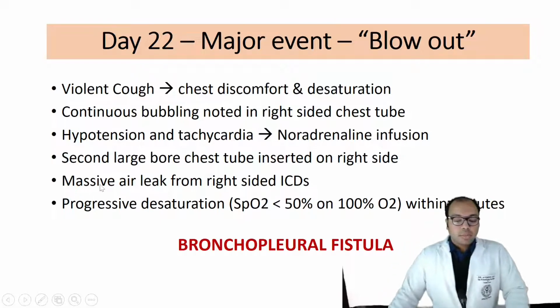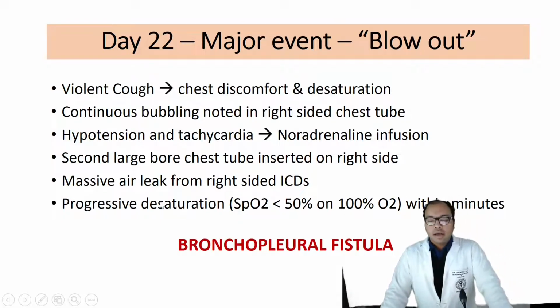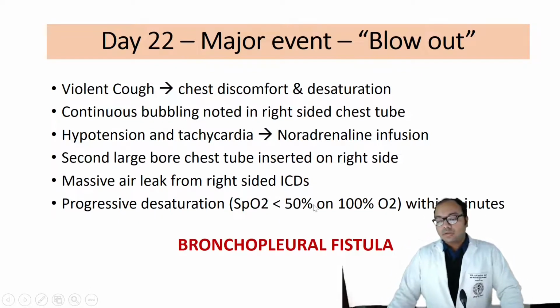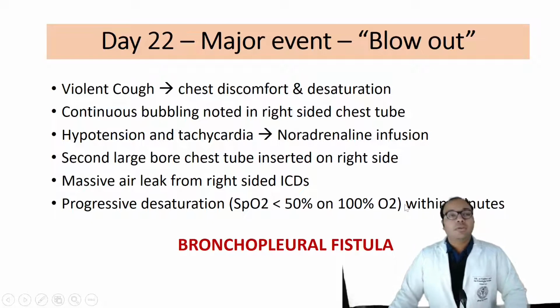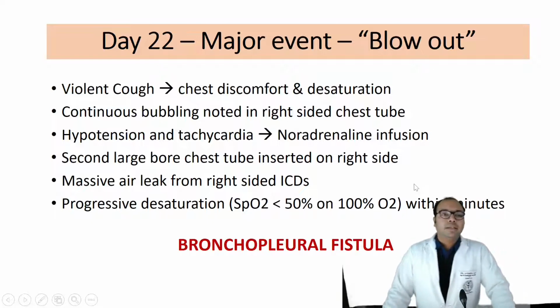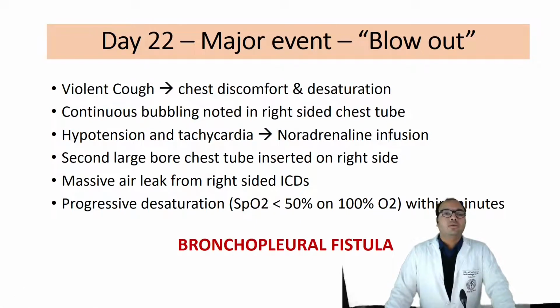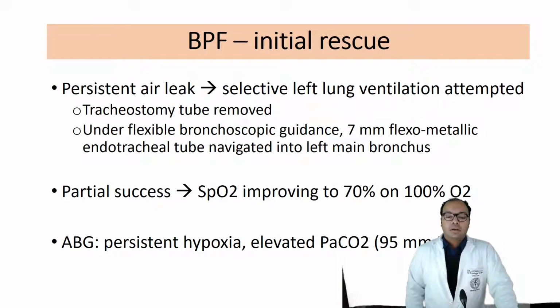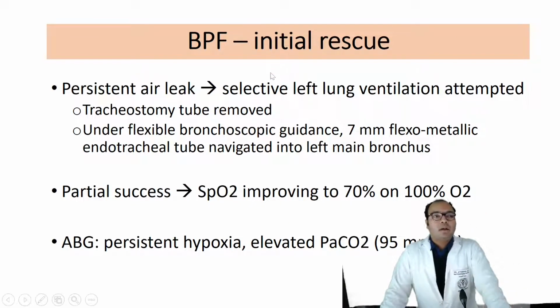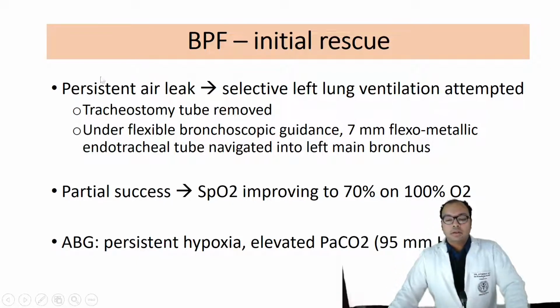However, despite putting in the chest tube, the patient was still desaturating, and the lowest saturation the patient decreased to was 50% despite giving 100% oxygen. So at this point, we started thinking about other rescue therapies and modalities which could save the patient, and time was also running out for us. The initial strategy that we employed was institution of selective left lung ventilation.